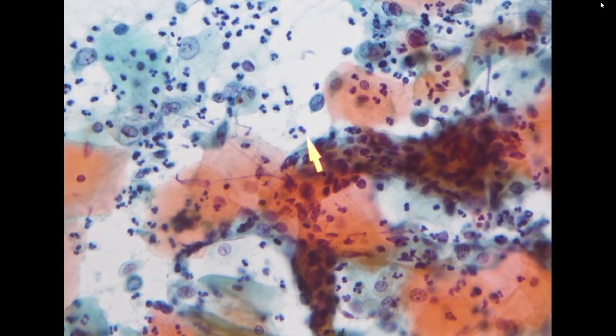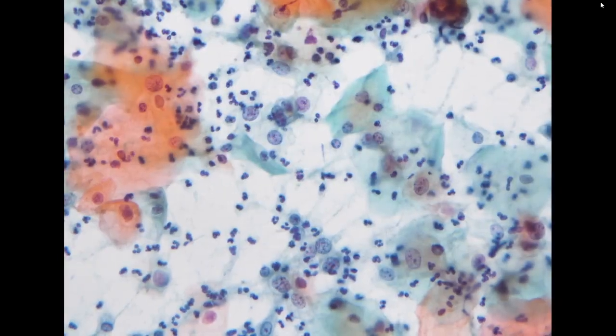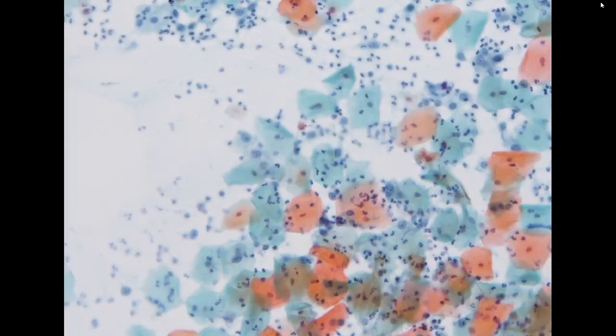There are some, you can see, so this is pretty good for HSIL if you can find these cells. This single cell has very high NC ratio, coarse chromatin, hyperchromasia, and this is good for HSIL. So I think we have HSIL here. For HSIL cases, we will go ahead and see if we can find any tumor diathesis.